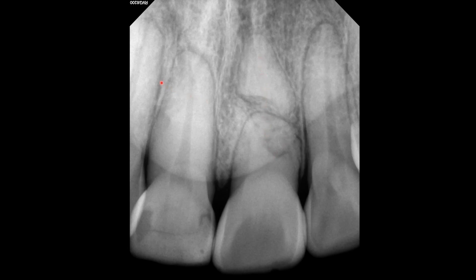Compare this with the right central incisor. The pulp canal is distinct. The apical PDL space seems a little wide.